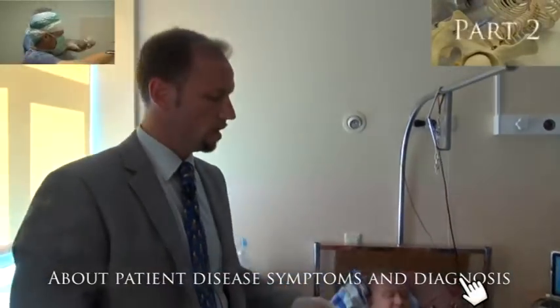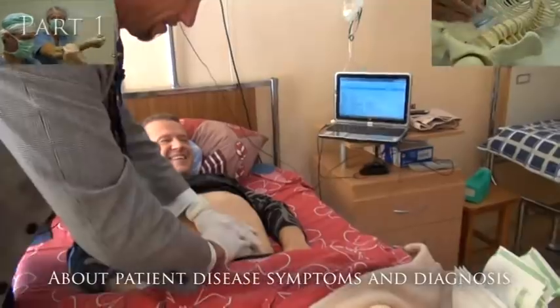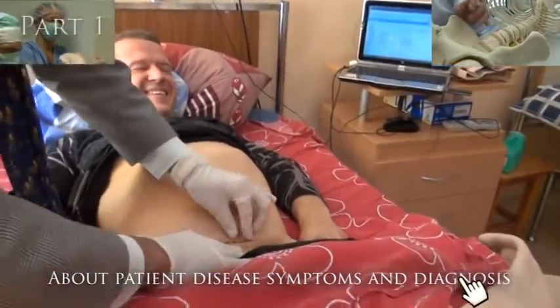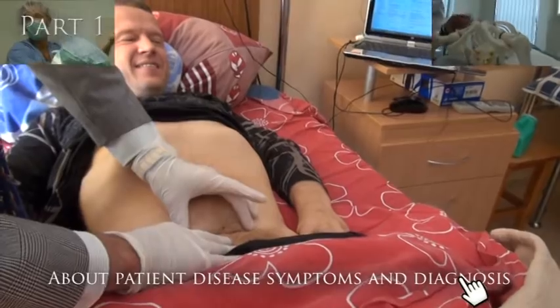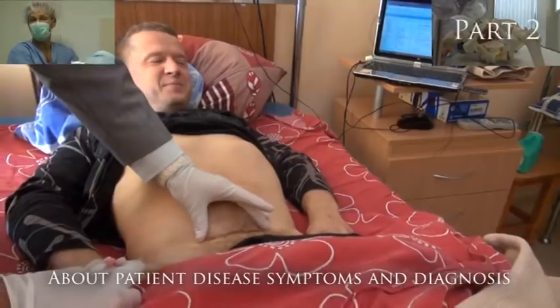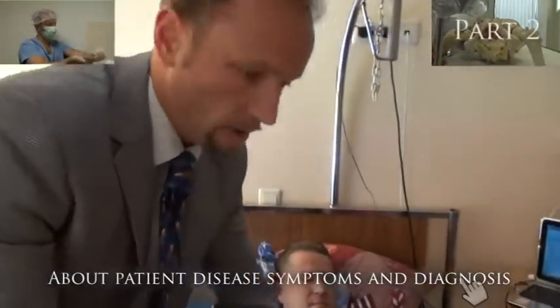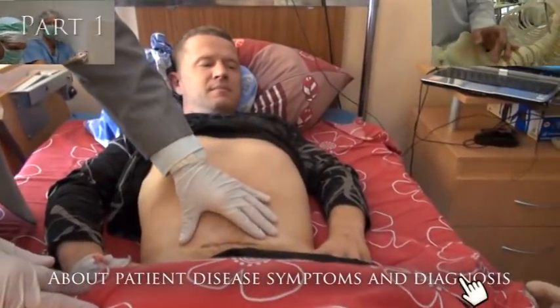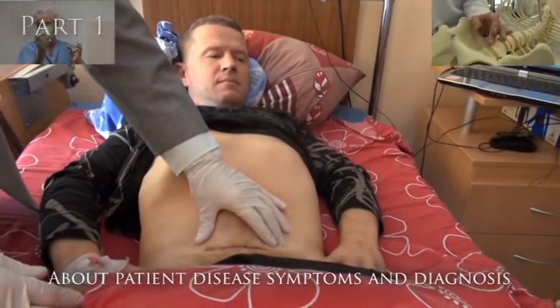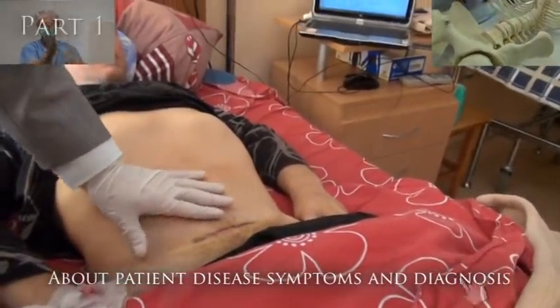This incision is approximately eight to nine centimeters long. Here is an intracutaneous suture, and such a stitch we are leaving for 14 to 16 days and then removing it.